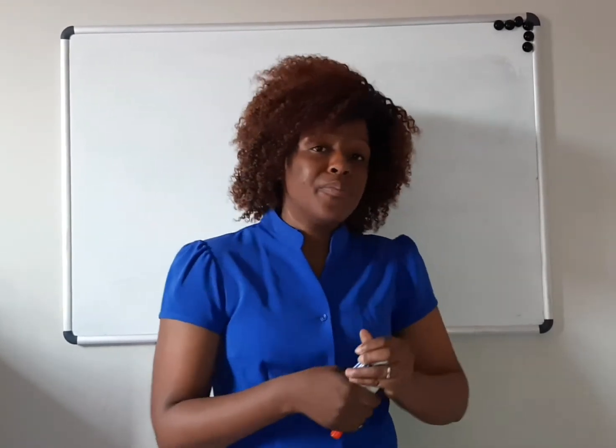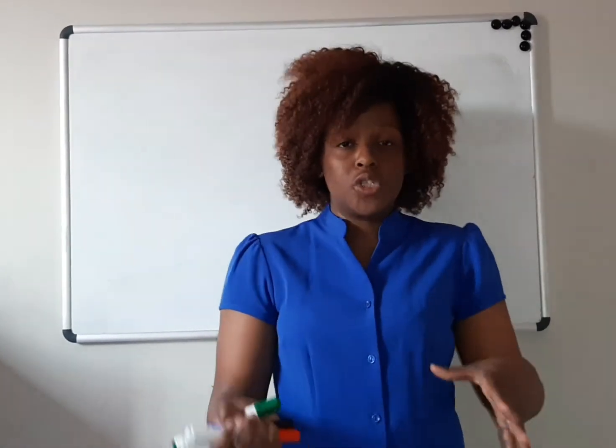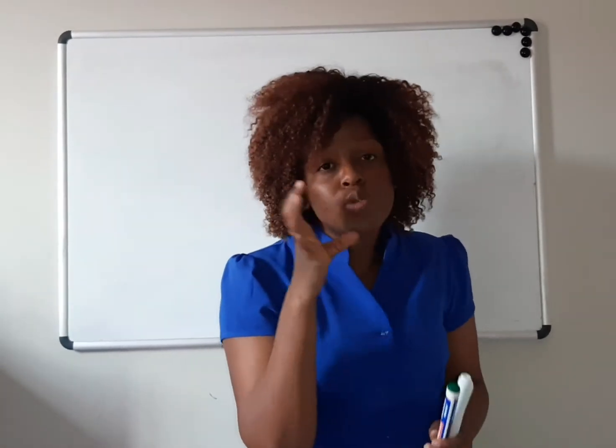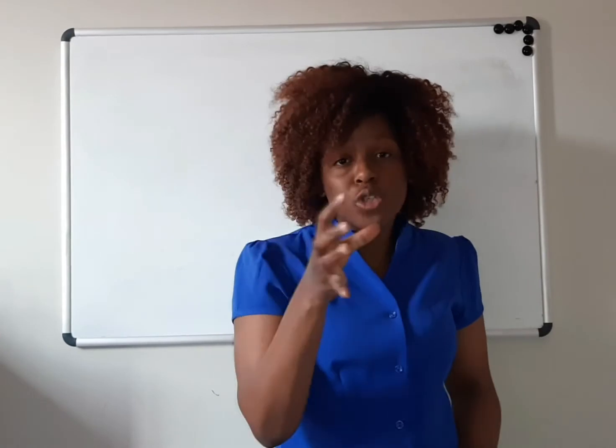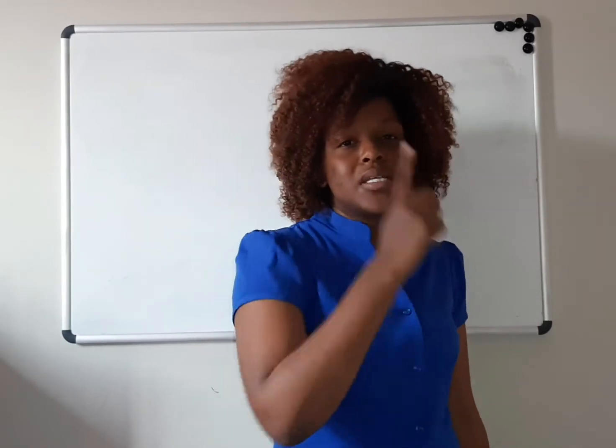When you calibrate, basically you are standardizing that instrument. So what do we use? We use a calibrator, which is a solution with a known concentration already. With some analytes on certain instruments, you will have maybe 6 calibrators with different concentrations that will aid in plotting the graph. But with some, you only have one concentrated solution with a known concentration, and when you put it in, the instrument will make its own dilutions, because you can't draw a graph with one point. It makes various points so that the graph can be drawn.